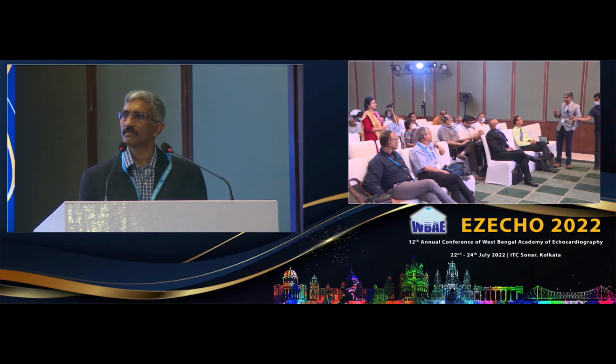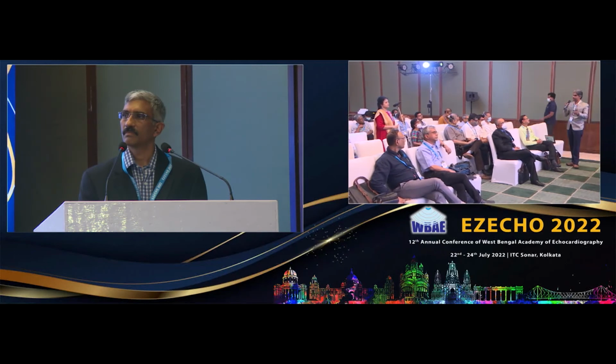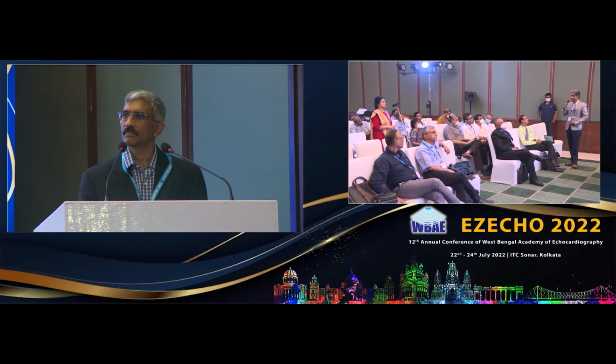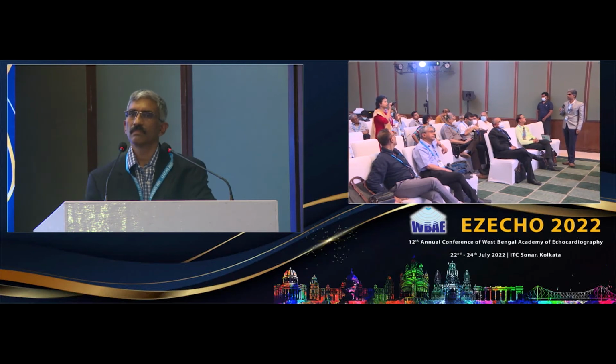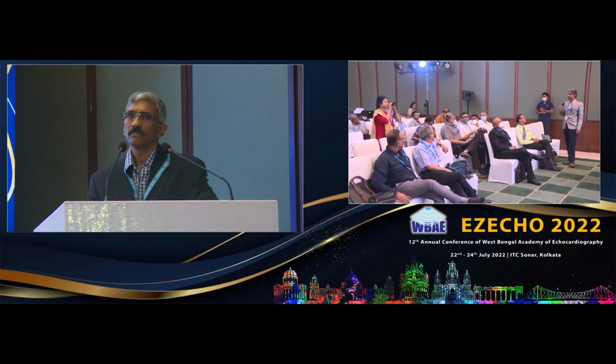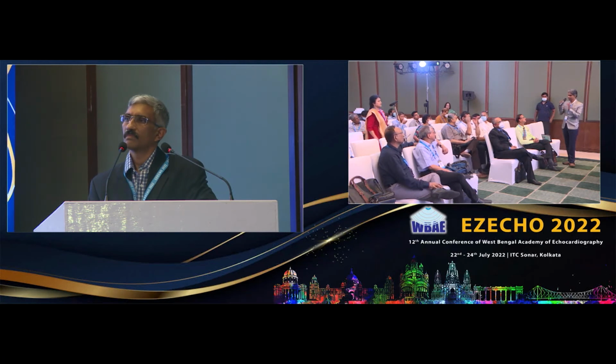Scans are very fast, we can do the imaging, but the only thing is if the baby is not lying down or not cooperative, then we may need sedation. No, I wanted to know whether there was any difference in the findings compared to the usual cases of cardiomyopathy or myocarditis that you find, with anything different in MIS-C or in children or adolescents. What we are seeing is almost the same only. We will be looking at the edema, we will be looking at the delayed enhancement, the scar.